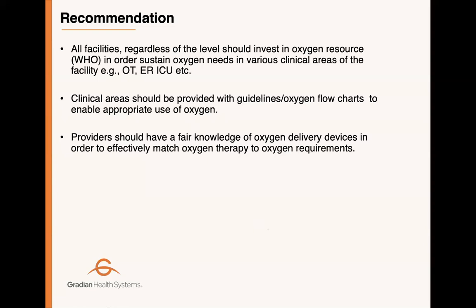But knowing that resources sometimes are quite constrained, I've seen places where you have only one pulse oximeter in the whole hospital or in the health center or facility. So I would just recommend clinical monitoring first.